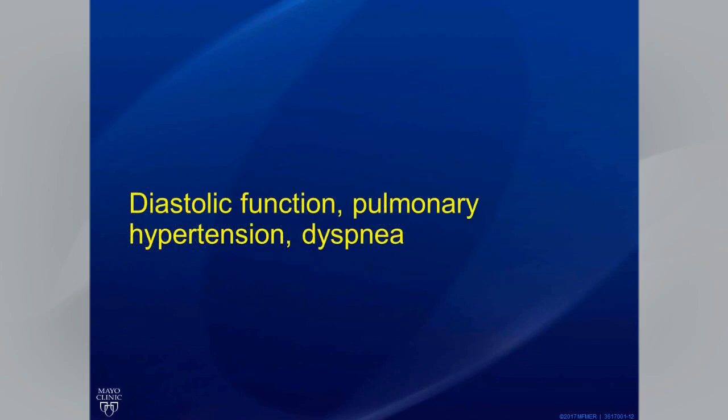Let us consider now the application of stress echo to assessment of diastolic function, pulmonary hypertension, or the patient with dyspnea. Now, diastolic dysfunction is recognized to be the main cause of heart failure symptoms in about 40% of patients with heart failure. So it's really important to recognize, and sometimes it isn't obvious from our resting echocardiogram.